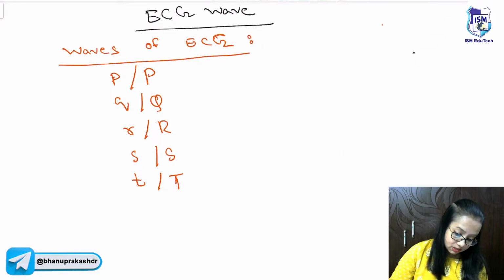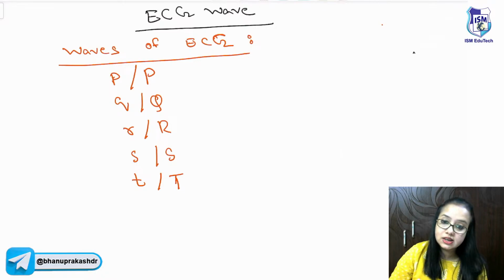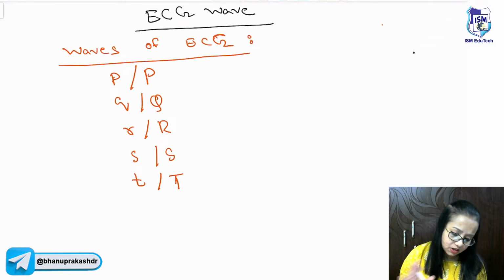What does V mean? V is just a nomenclature that is given to make us understand it is augmented, that it is empowered. A is augmented, V is given to designate the unipolar lead. This is done by the scientists. It doesn't have any other meaning. What we have to remember is AVR means that the right arm has the positive input.